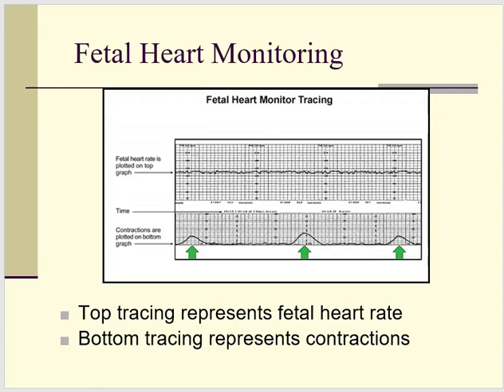When we are using continuous fetal heart rate monitoring, which is far and away the most common thing you will see with your patients who are in labor, this is what you're going to be looking at. This top tracing here represents your fetal heart rate, so that's where your baby's heart rate is. The bottom tracing here is the contractions. So here is your Doppler ultrasound. Here are the results from your TOCO.